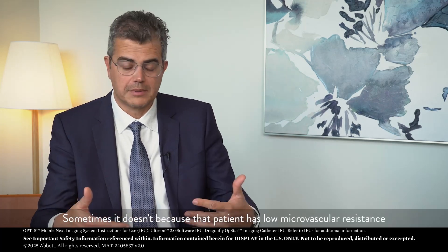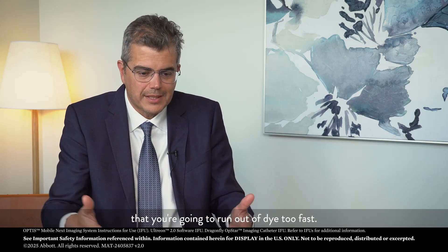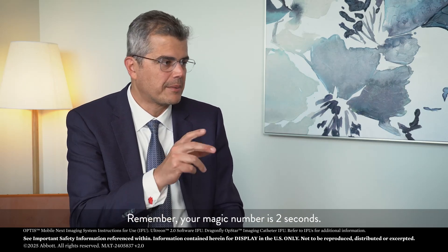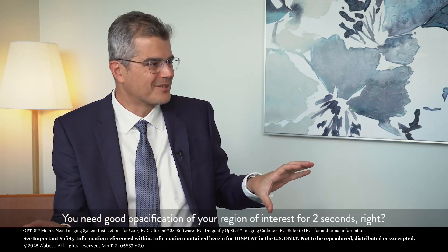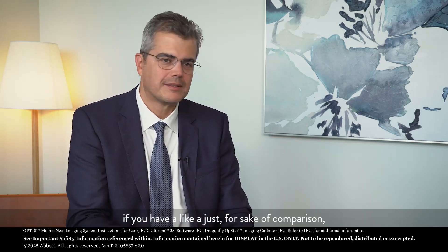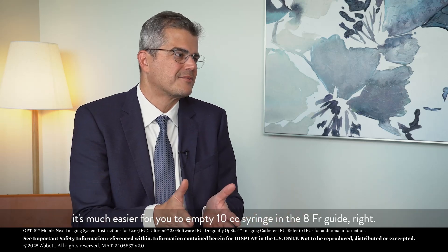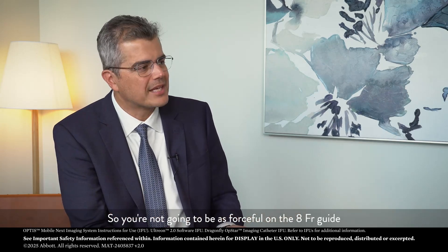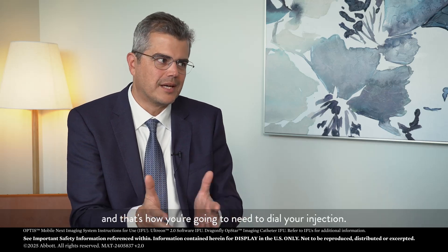Sometimes that requires a vigorous push on the syringe. Sometimes it doesn't — if the patient has low microvascular resistance or is hypotensive, you'll run out of dye too fast. Your magic number is two seconds: you need good opacification of your region of interest for two seconds. You'll need to fine-tune based on guide size — for example, it's much easier to empty a 10cc syringe through an 8 French guide than a 6 French guide, so you won't need to be as forceful with the larger guide.